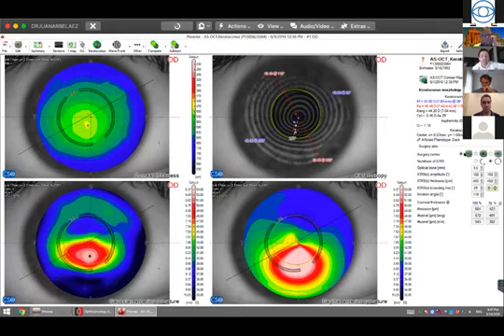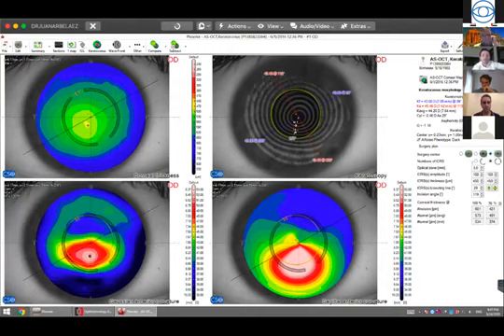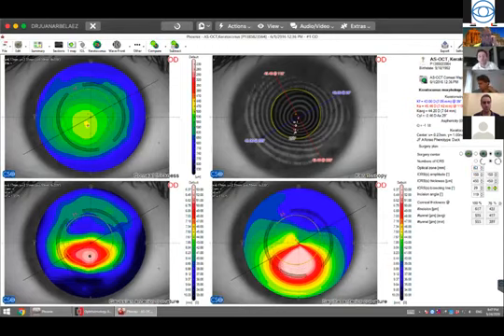You can select different diameters, since the rings come in different optical zone diameters, so it allows you to play with that and select different ring arc lengths. We can decide to implant a ring with a shorter or longer arc length, see what we are planning to do, and adjust our plan according to the needs of each case.